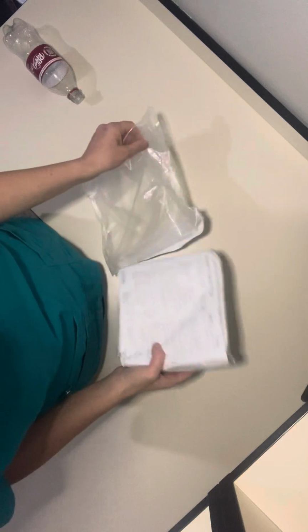Okay, and then I'm gonna grab my equipment. So when I get my Foley tray, I'm gonna make sure that it's the right size, that the expiration date is good, which everything's good here. It's already open because I messed up the first video. But okay, so I'm going to get started. And I would also make sure I verified the order next to the patient too, as they were giving me their name and date of birth and all their identifying factors.